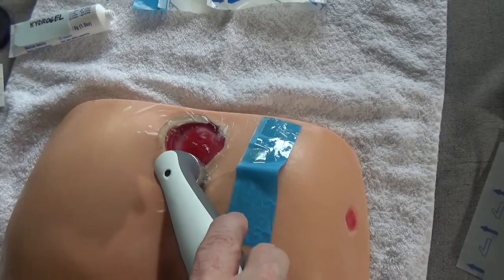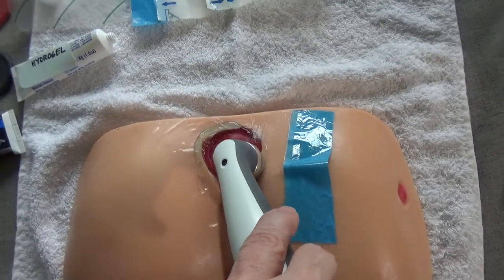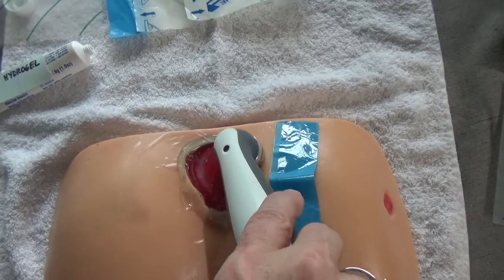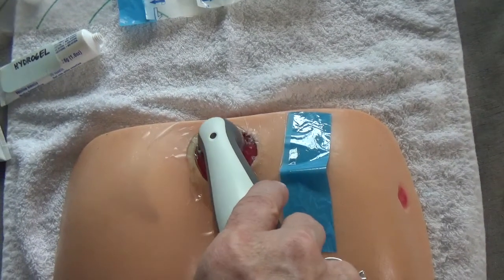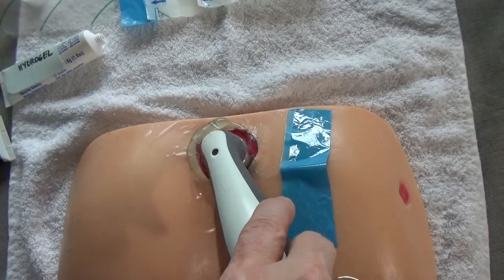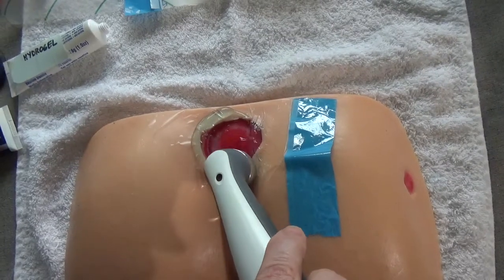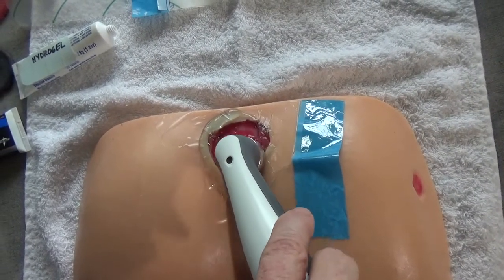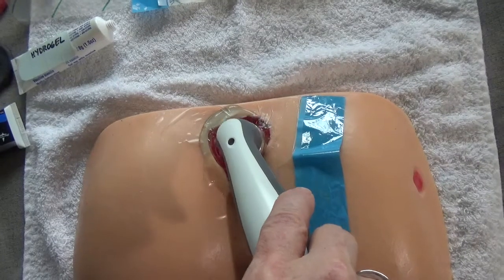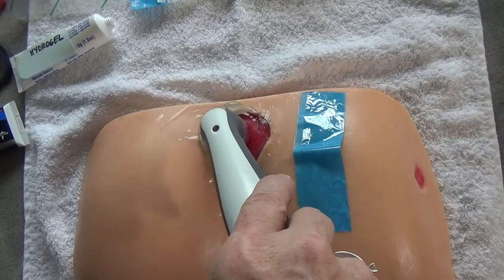is. Can you go outside the wound to the edges of the wound? Certainly. That is an acceptable treatment also. Okay. Slow circles. You don't have to press down hard. The energy is moving through the thin film and through the hydrogel on the wound side.